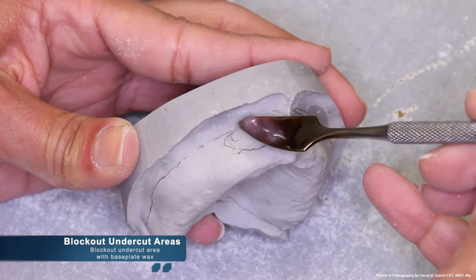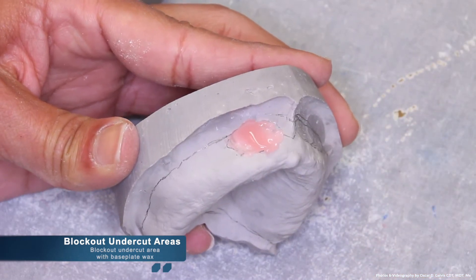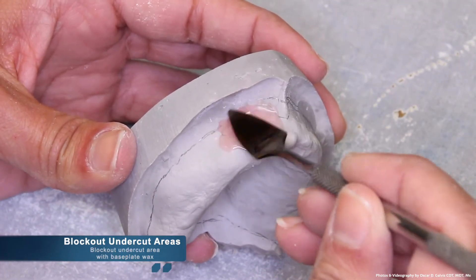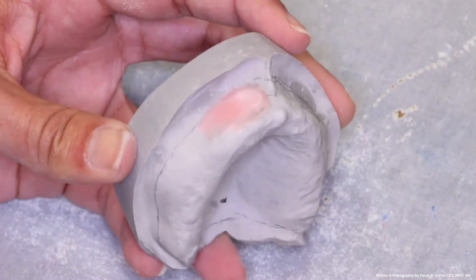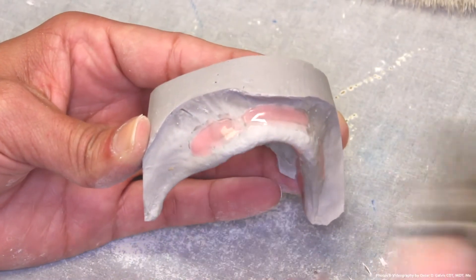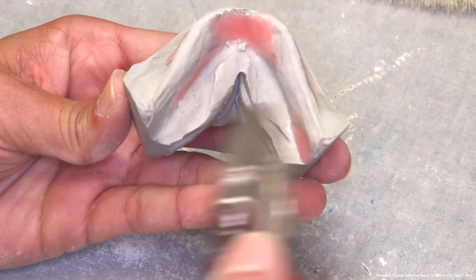Once the undercut areas have been designated with a pencil, we can now block out these undercut areas with base plate wax. It should be noted that undercuts are not necessarily a bad thing. In fabricating the complete denture itself, we look to undercuts to make sure the denture has retention in the mouth. However, in this instance, we are making a custom tray. Custom trays must be easily placed intraorally and retrieved. If undercuts were being engaged, the tray would have a difficult time capturing all anatomical structures without causing scraping of the impression material off of the tray.